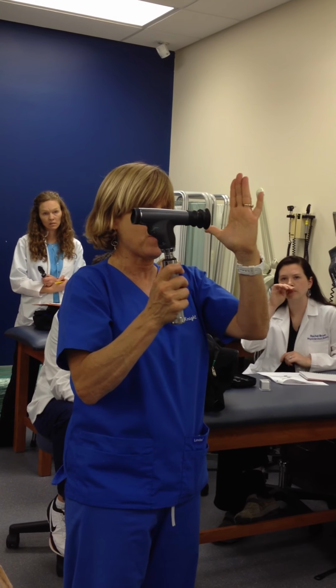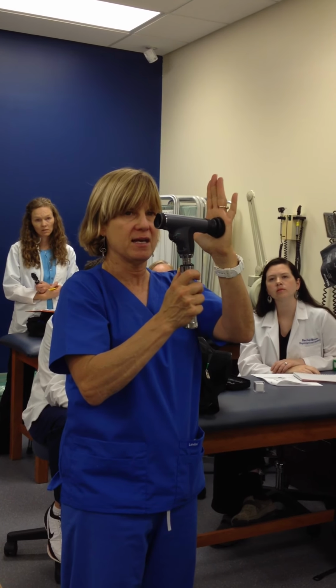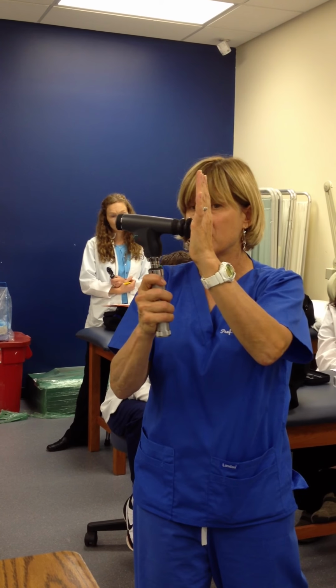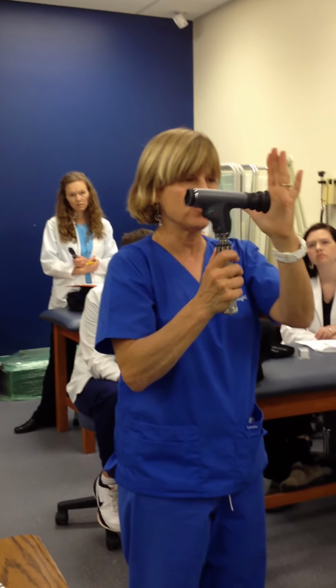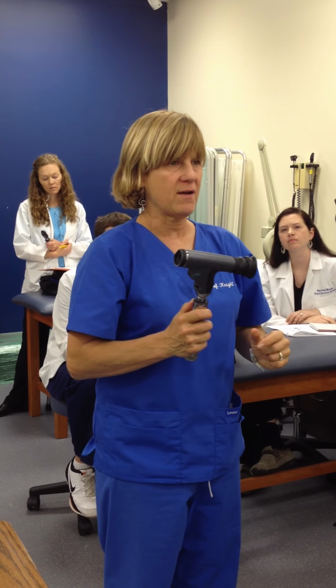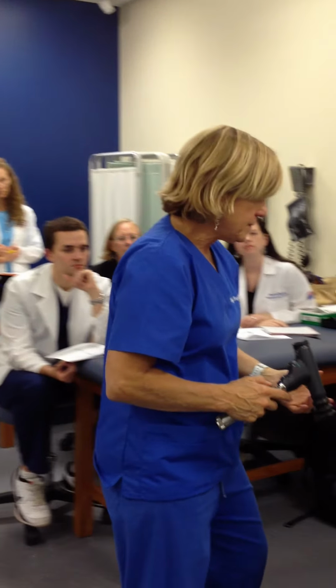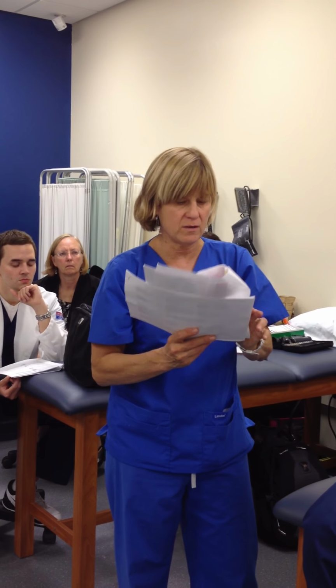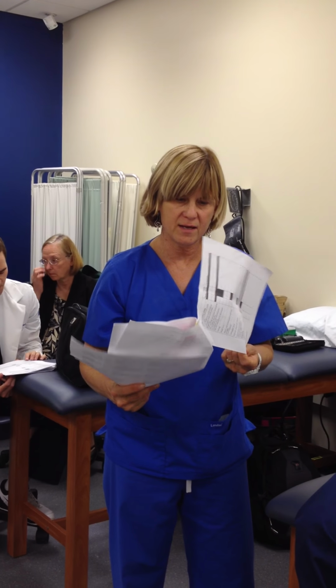But do try to practice so you drive straight in, and then you darken that completely, and you'll be able to do it much better. Okay, so just drive it straight in. All right, that's that. And then you say all this stuff on one eye, and then you go to the next, and I think we're done.